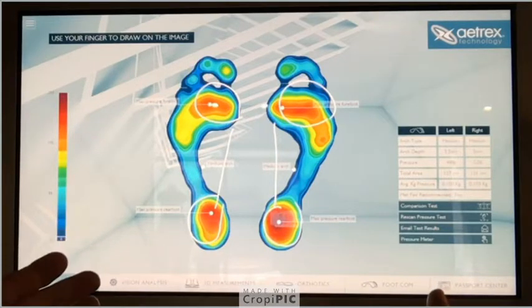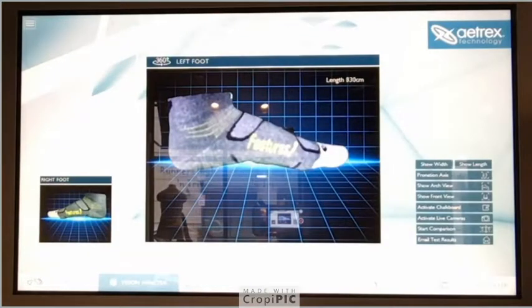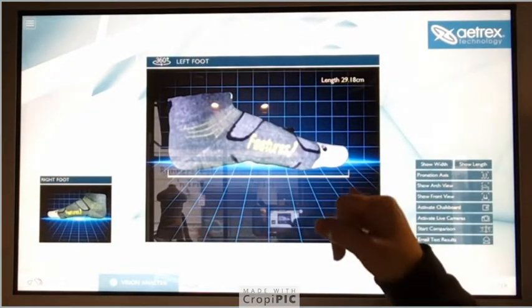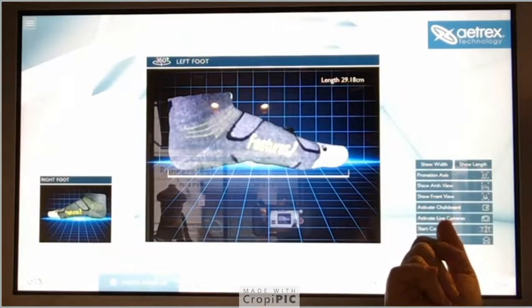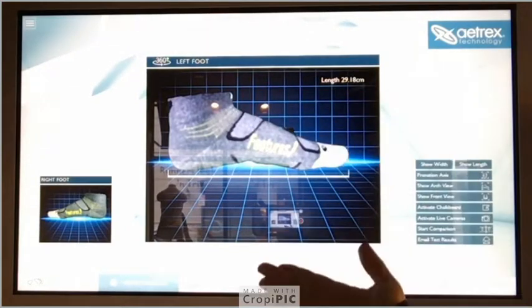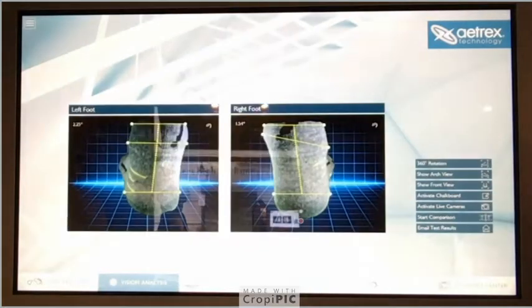It helps us show visually what we are seeing ourselves, and then the customer can see it too. Sometimes customers say the left foot always feels tighter than the right foot. Because the size of your feet can be different, it also shows a little bit of whether you have pronation or similar issues. This is just one part of the fitting we do — after this we still have you walk and we watch your feet in motion.